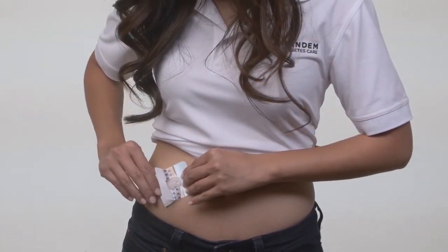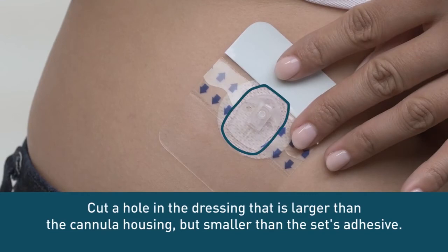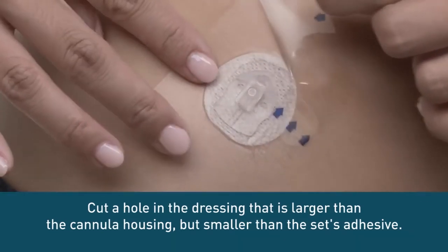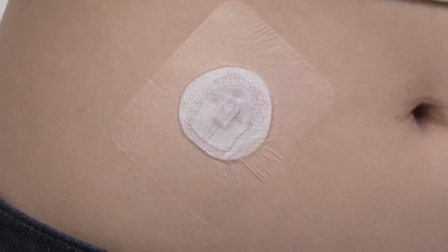Another option is to place an adhesive film or dressing on top of the site for an extra layer of protection. One advantage of this option is that you can use it whenever you notice your set getting loose, or before specific activities like exercise or swimming, and you're not limited to using it only at the set change.